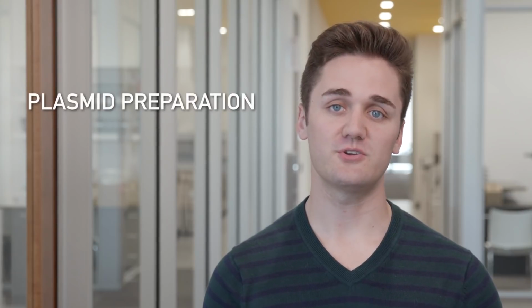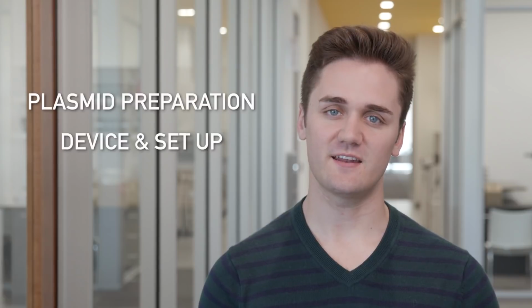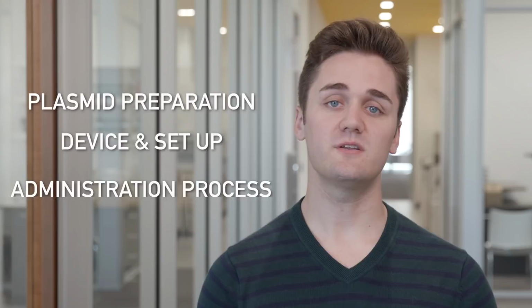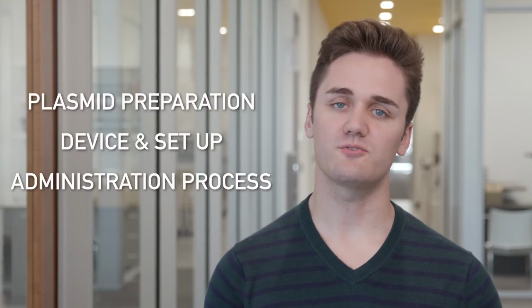The video is divided into 3 sections. In this section, we will review the process for the plasmid preparation. During the second section, we will discuss the electroporation device and setup. In the third and last section of the video, we will walk through the administration process. But first, let's start with a quick overview of Tavo and electroporation.